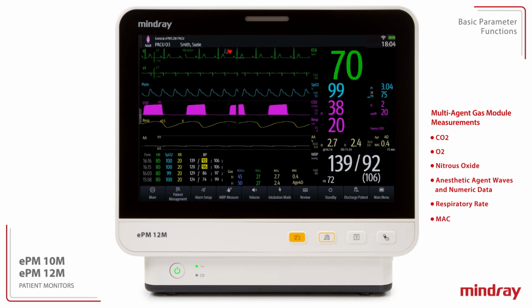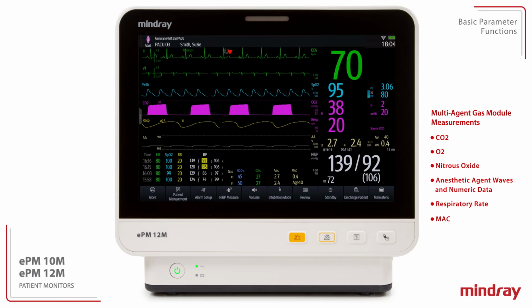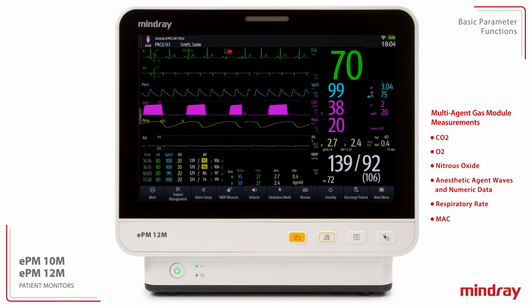To begin agent and capnography monitoring, connect the patient's sample line to the water trap on the multi-agent gas module. Once the sample line is connected to the patient's airway, startup is complete. The ePM 12M patient monitor can be connected to a scavenging system in accordance with facility policy.